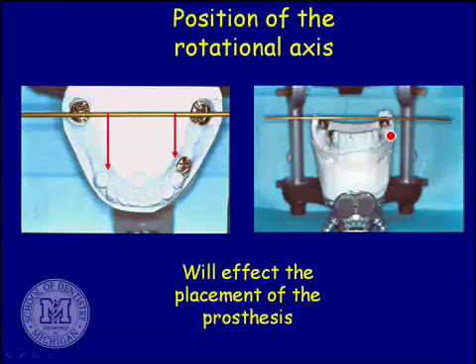But it really does wind up that they're real finicky to design, and for the lab to do them so that they work well, they're finicky. But if you find a lab that can work that way, they really do work quite well. And in many of these cases, so again, where you've got the mesially and lingually tilted molar, it's real easy to do these kind of partials instead of trying to fight and find some way to figure out how you're going to get your framework to fit around those tilted molars for you. So again, they're a little more challenging to design, and your lab has to be on their game to make these things so that they come out well, but when they do, they aren't any harder at all for the patient to physically place and take out. Actually, they're a little bit easier.